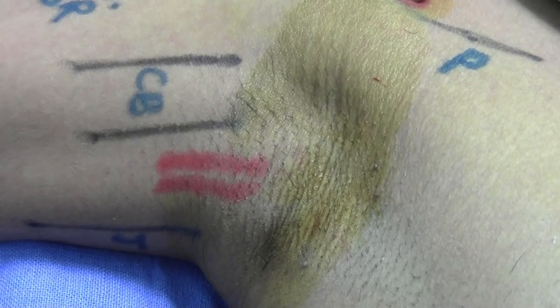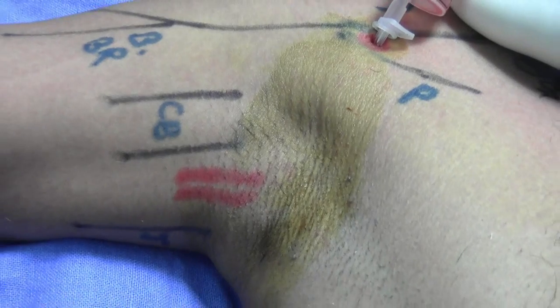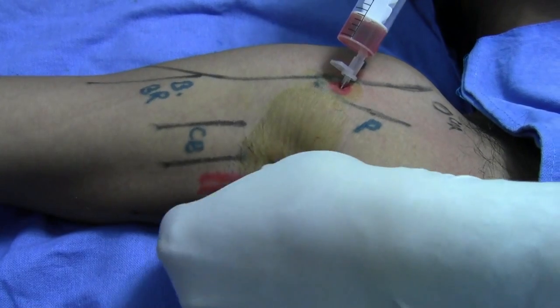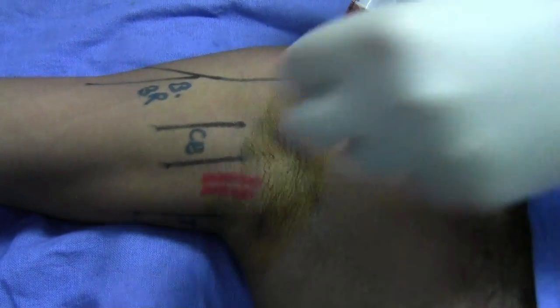You should be very careful to avoid accidental intravascular injection. The skin is free but the underlying sheath is ballooned up. Now withdraw the needle a little bit.